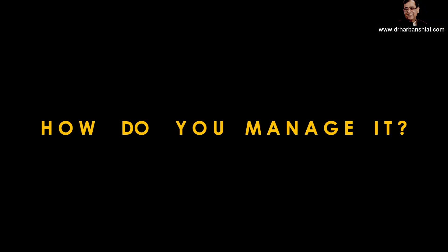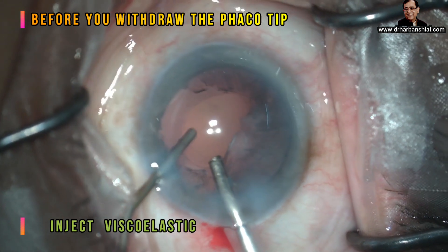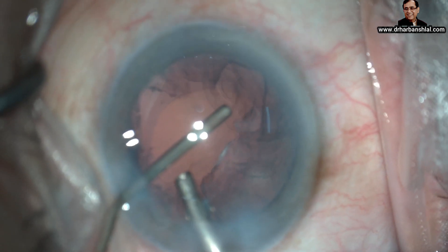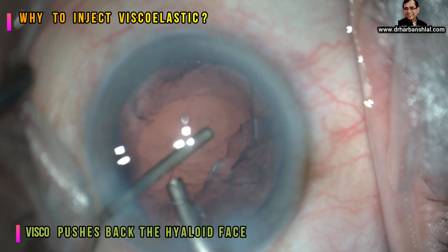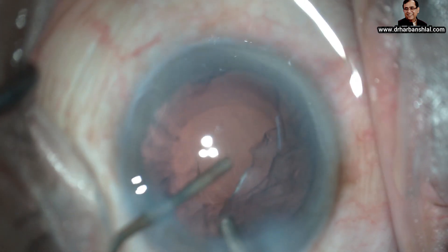Let us now see how to manage the case of an inadvertent posterior capsular tear. Before you withdraw the phaco tip, inject some viscoelastic to avoid vitreous prolapse into the anterior chamber. Filling the AC with viscoelastic pushes the hyaloid face back, and now we can remove the phaco tip.